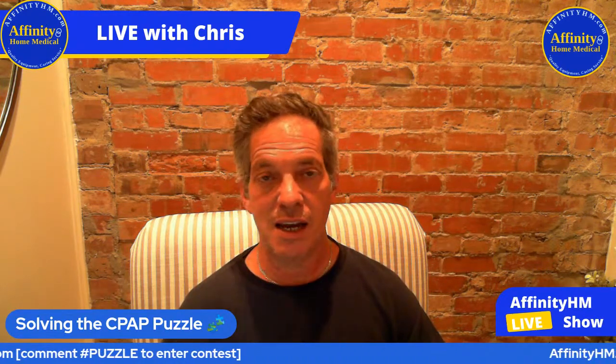All right. What is best to clean the CPAP mask? Gary's asking. What's the best way to clean the CPAP mask? Well, if you look in your owner's manual for your CPAP machine, it's going to tell you clean the mask with soapy water only. Soapy water is a wonderful way to clean, and it does work. If you're using soapy water, you just take your mask, disconnect it from the hose, go over to the sink, or maybe get a nice clean tub to work in, and use just a little Dawn dish detergent and soapy water, and rinse it all real thoroughly, let it air dry.